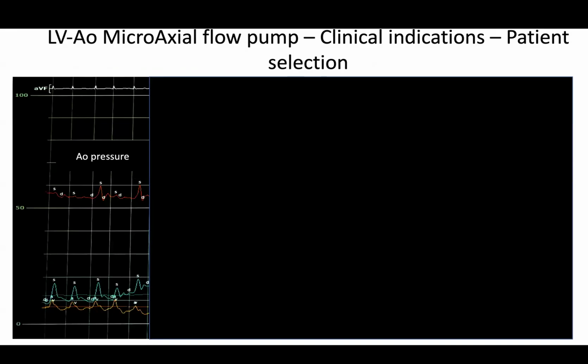I have this case because it really struck me when I was a fellow, and I always presented it in this meeting. This is someone that came in with a large LAD wraparound STEMI, never forget. And here are the hemodynamics. Since we have a new batch of fellows, what do you think about these hemodynamics? You have an AO and then a Swan down here.